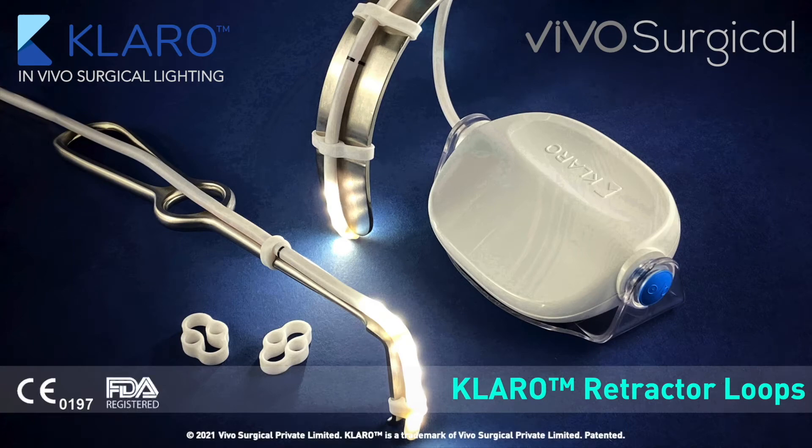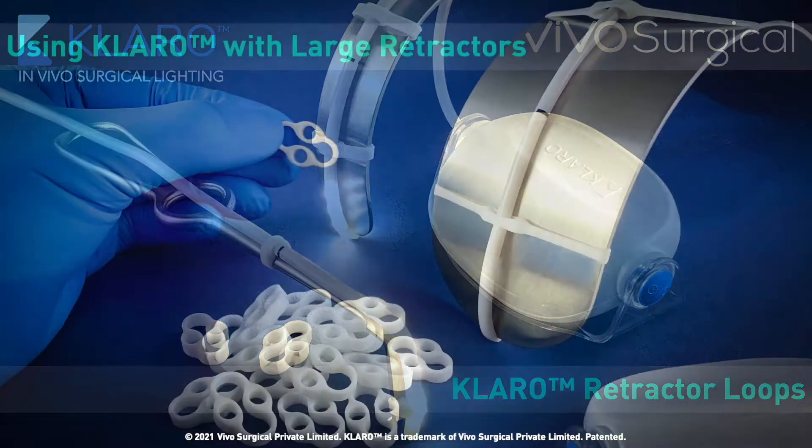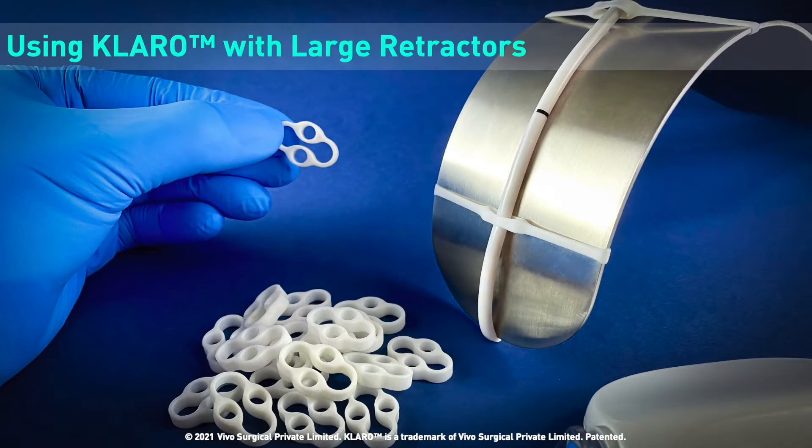Welcome to the Claro retractor loop demonstration video. In this section, we will introduce the retractor loops and their application for large retractors.